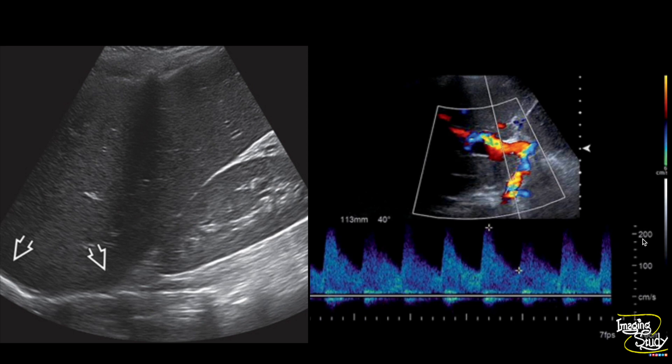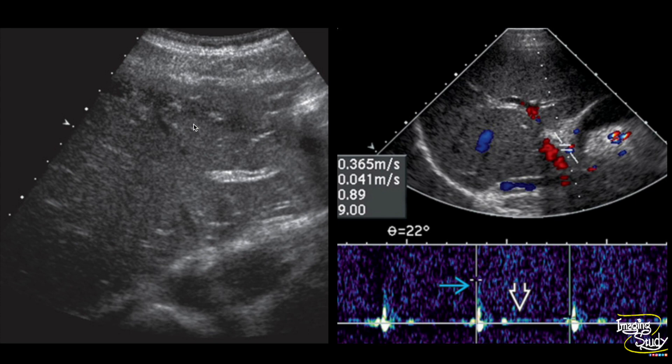On the right image, an anterior oblique transabdominal ultrasound in the same patient shows an elevated hepatic arterial peak systolic velocity of around 220 centimeters per second, which is quite higher than normal. In the transverse section of the left lobe, the liver parenchyma is slightly hypoechogenic in a case of acute fulminant hepatic failure from acetaminophen toxicity, showing a high peak systolic velocity along with a high resistive index of 0.89 in the hepatic artery.